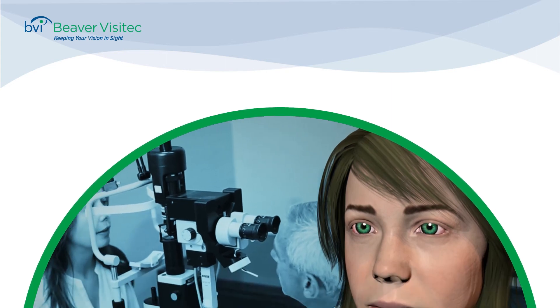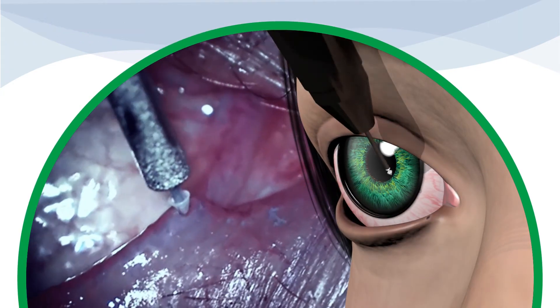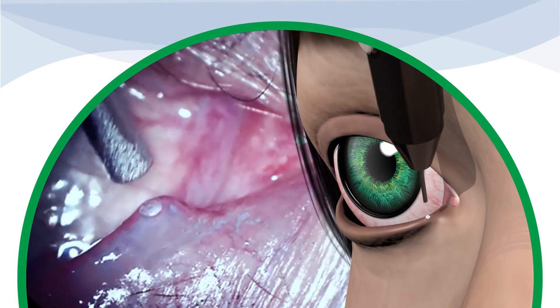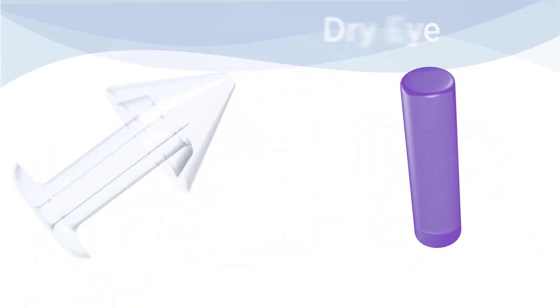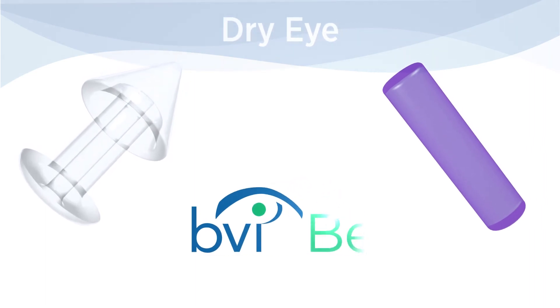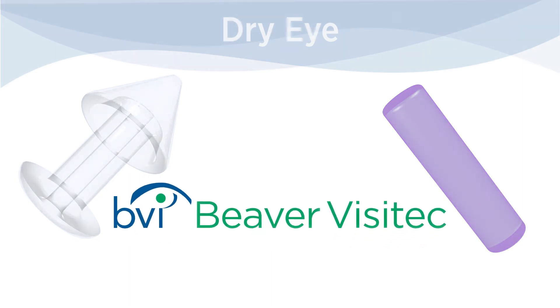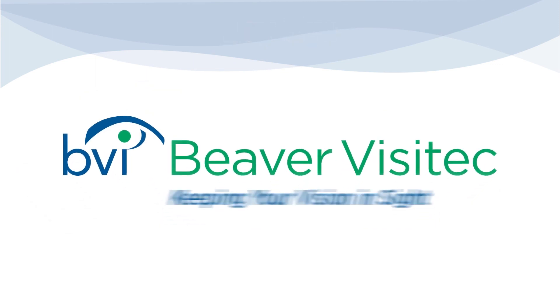So as you can see, punctal occlusion is a quick, painless and simple procedure. Whether you use the permanent Parasol punctal occluder or the dissolvable Extend implant, you can provide the best comprehensive care to your dry eye patients while adding value to your practice. Beaver Visitec — keeping your vision in sight.